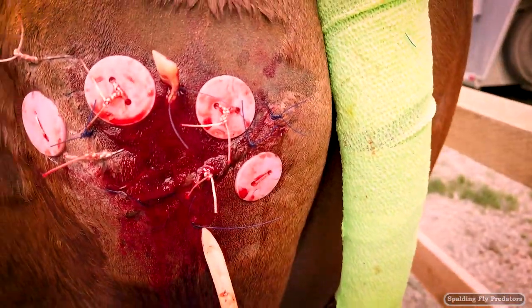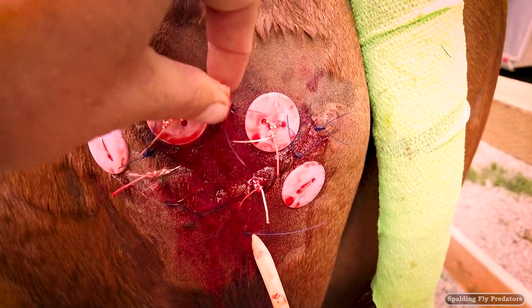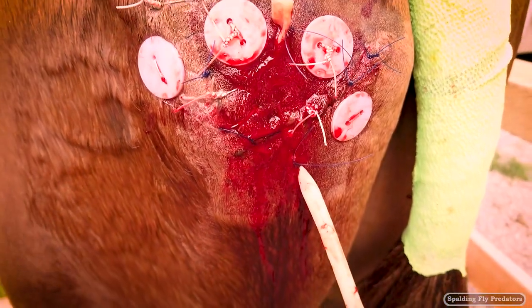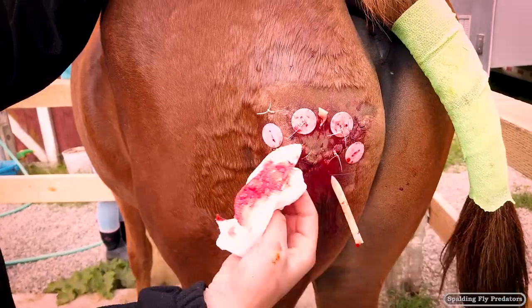The drain will stay in for about three days and then they can remove that. There's one suture up here holding it in and another one down at the bottom, so that'll come out in three days, and then the sutures themselves can come out in two weeks.